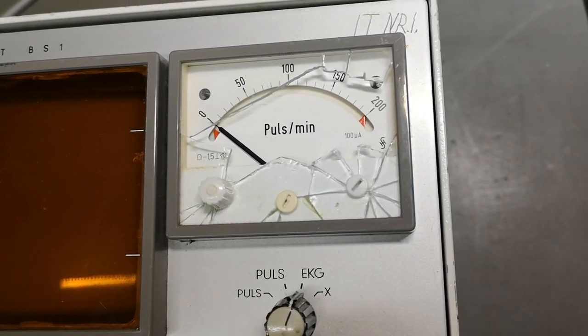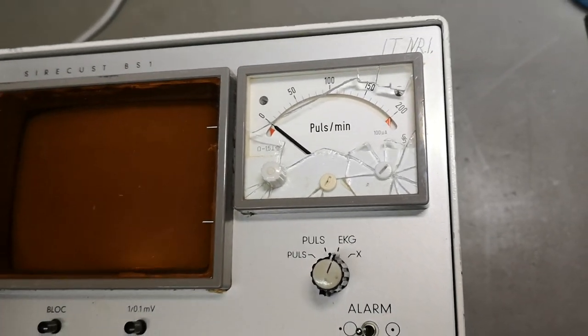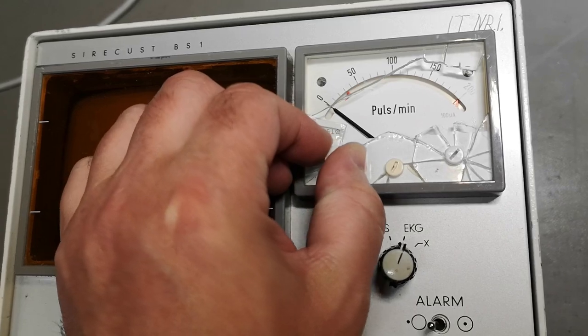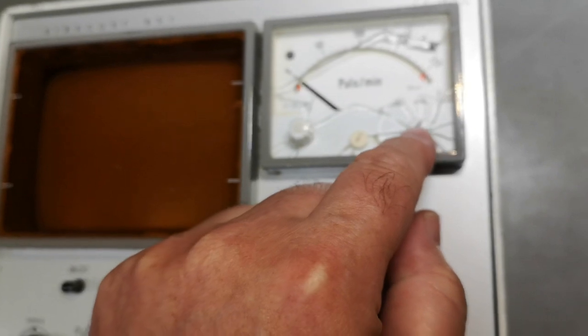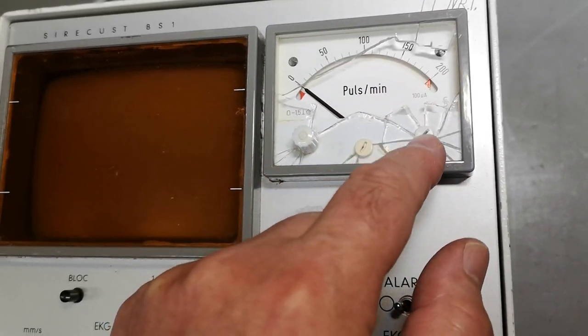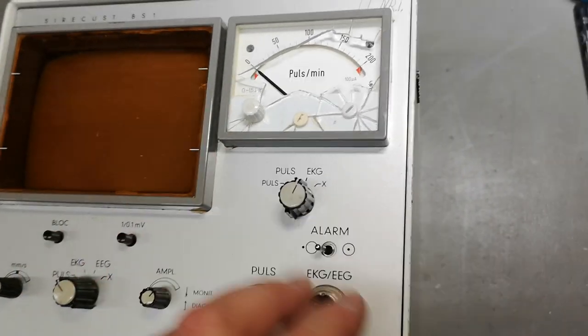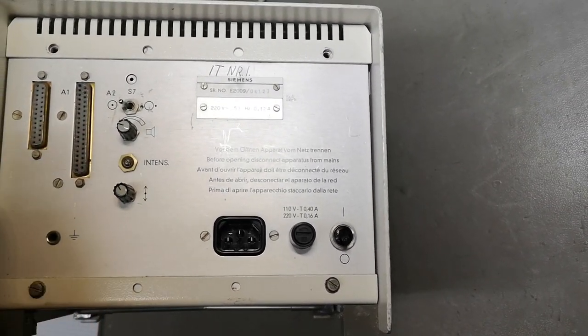The glass is broken, but that's what happens when people throw stuff out and somebody else picks it up. I think this is the alarm level here, and with this one you can also move the maximum alarm level. This is of course for the metering.